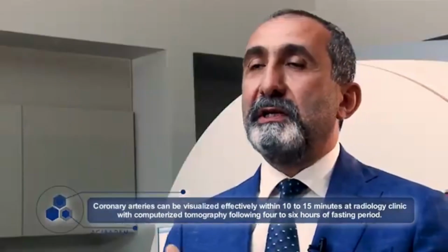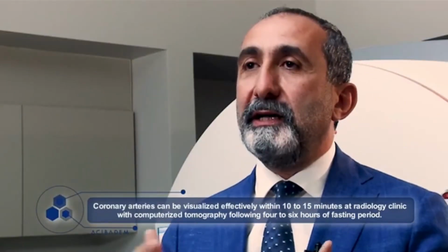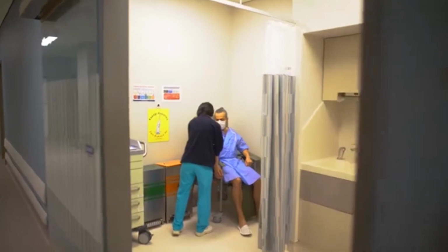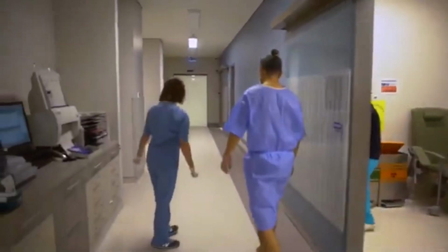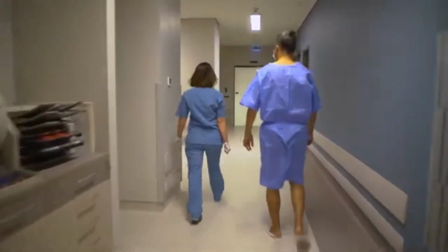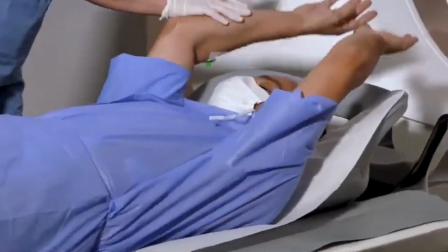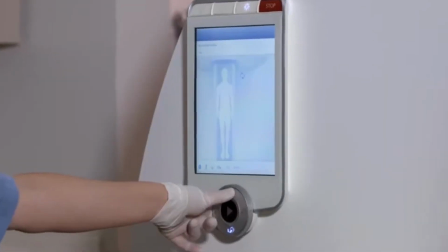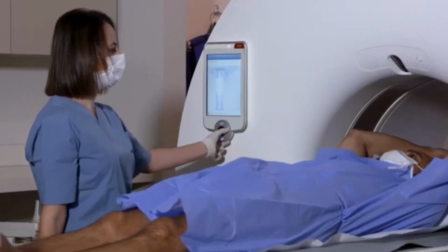Coronary arteries can be visualized effectively within 10 to 15 minutes at radiology clinics with computerized tomography following 4 to 6 hours of fasting periods. Structural deformities and diseases of the coronary arteries can be visualized with tomography scanners within a very short period, less than 1 second, during administration of an iodinated contrast agent in low doses into the vein of a patient's arm.